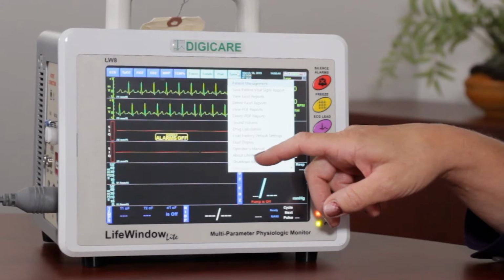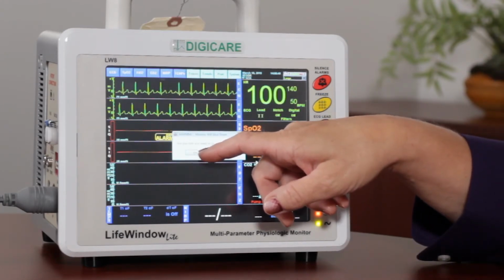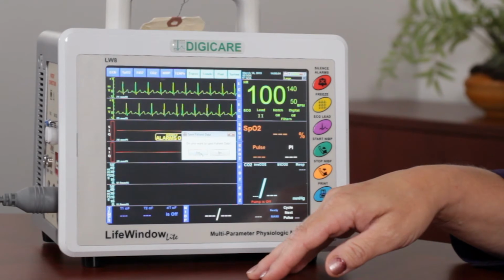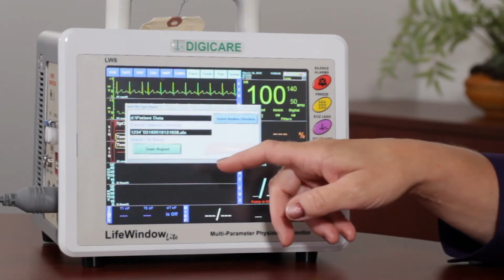We do recommend shutting down the monitor this way, so you would click shut down. Are you sure you want to shut down the monitor? You would say yes. And then here it's going to prompt you if you want to save your patient data. If you know that you've already saved it, you can click no. If you do need to save it, you would click yes.